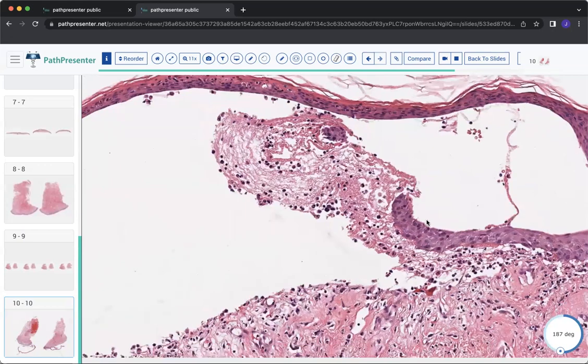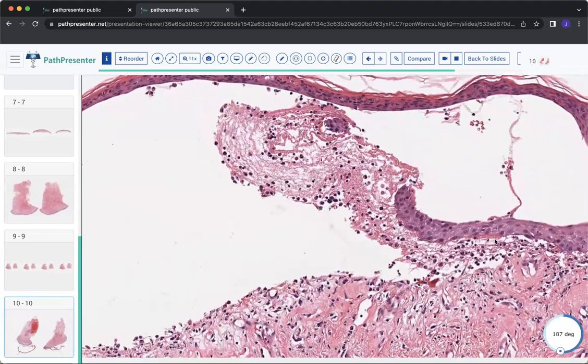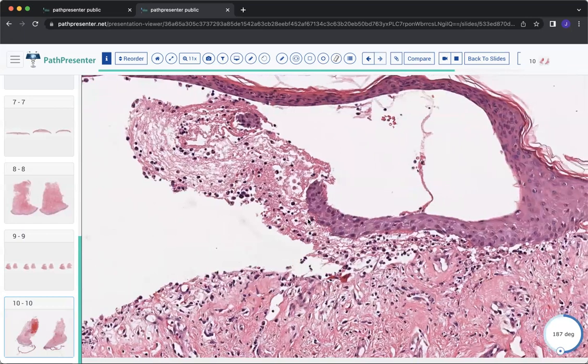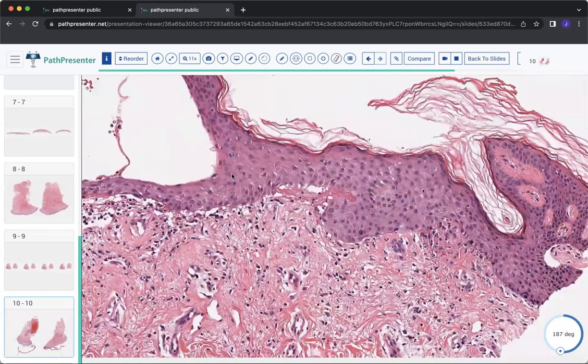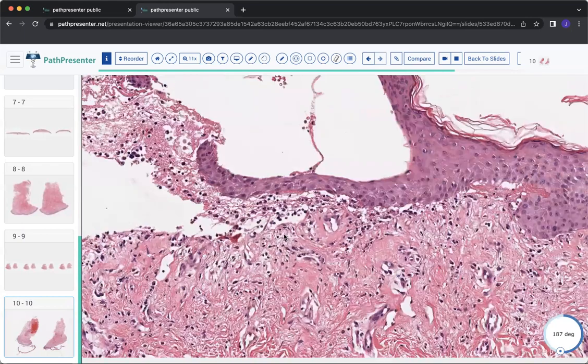It could be epidermolysis bullosa acquisita. It could be bullous lupus. And if you have a subepidermal blister with a lot of neutrophils, you could think about linear IgA bullous disease, right? And even DH. So you have to have some clinical information or a DIF piece of data to truly hone in on the diagnosis, or they just have to give you ones that don't make sense.